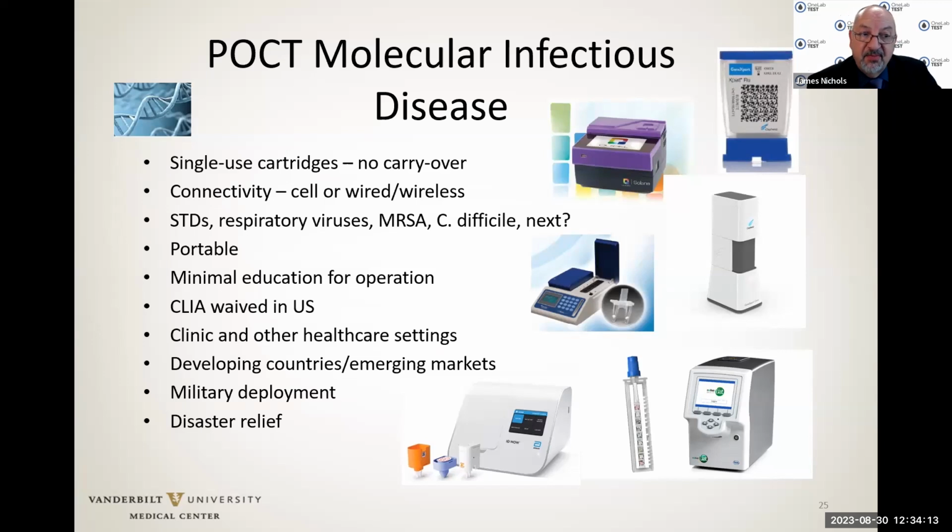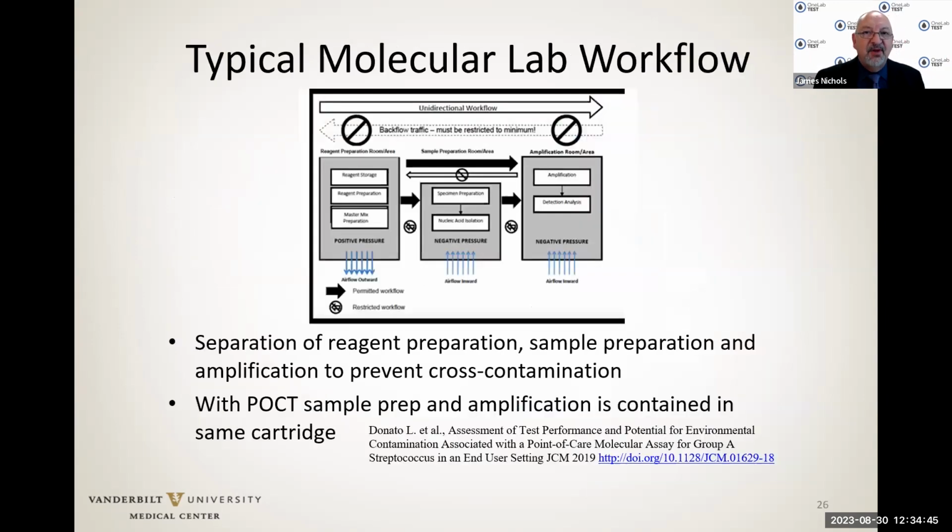Some of these are portable, some are not. They are very simple to operate and require minimum training and education. They are CLIA waived in the United States. In clinic, healthcare settings, developing countries, emerging markets, military deployment, even disaster relief, they found applications. But as we were looking at what could go wrong with this particular test, we were very concerned because as a laboratorian, I'm used to our typical molecular laboratory workflow.